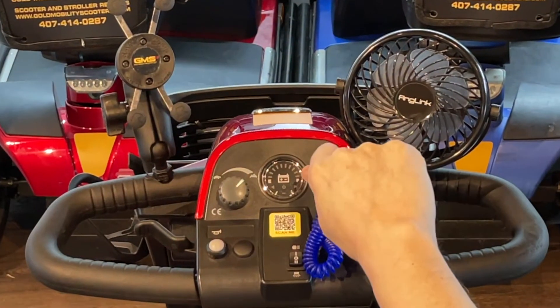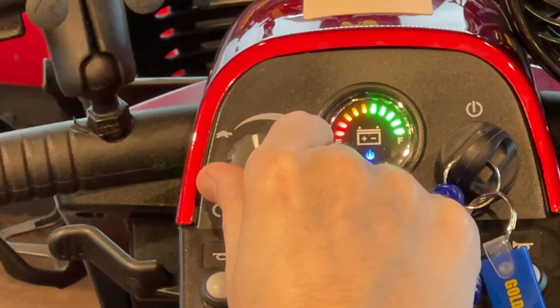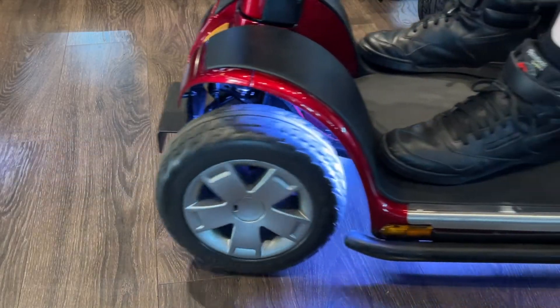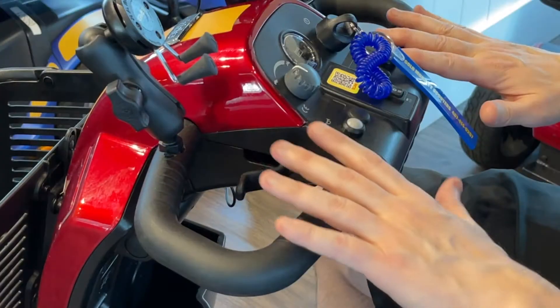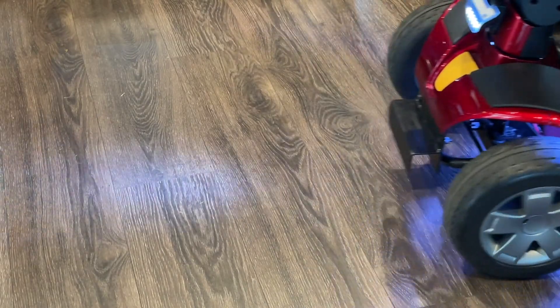Next, turn the key on without touching the handlebar and set your speed control. Then grab the right trigger to move forward. You'll steer left and right using the handlebar. Just let go of the trigger to stop the scooter. Note that grabbing the left trigger allows the scooter to go in reverse.